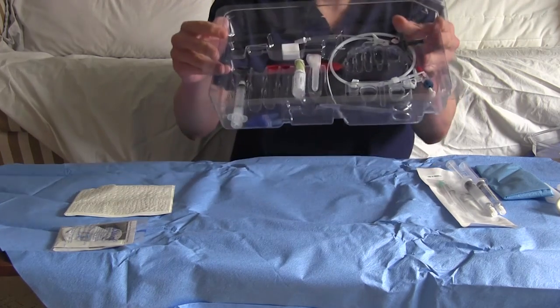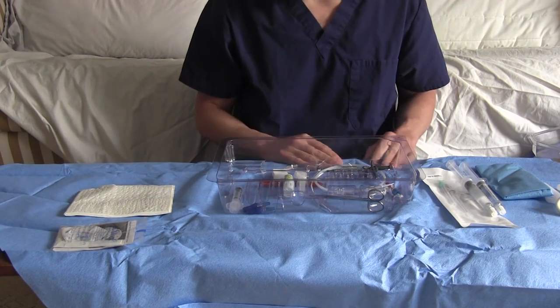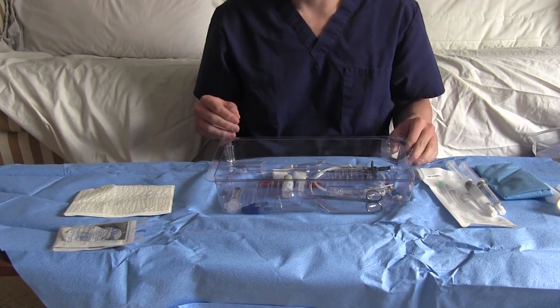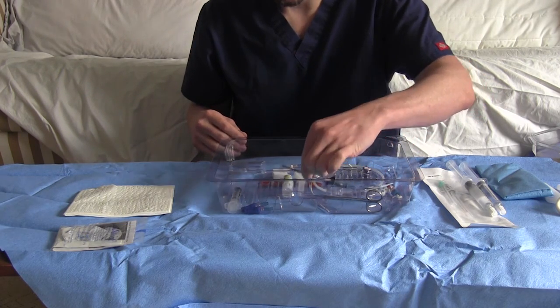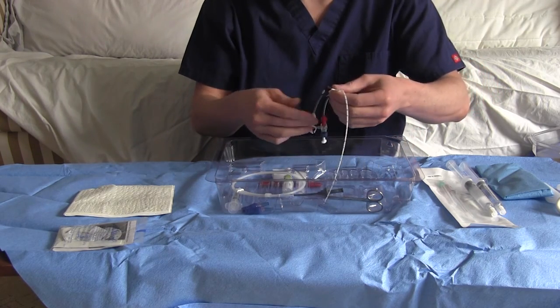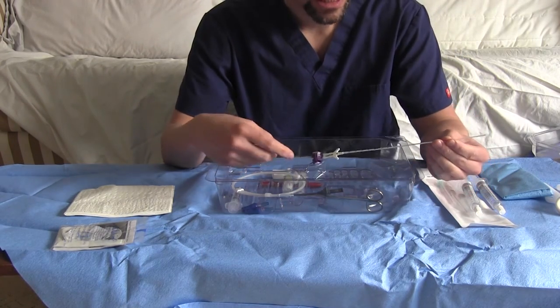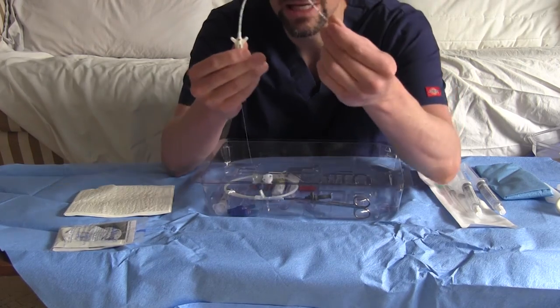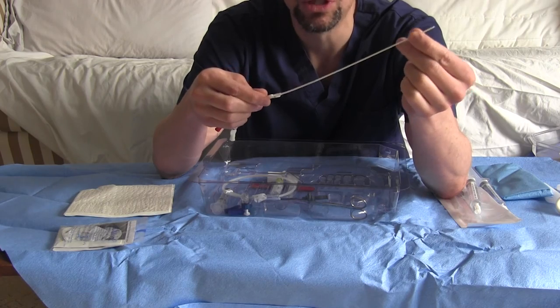And now this is the actual procedural portion of the set. And we're going to go through these one by one. So there's a lot of prep work that goes into this kit. What you want to do first is prepare your catheter. And that's a little bit more complex than you may be used to dealing with regular central lines and such. So I'm going to take you through it step by step. This is a 20 centimeter midline, but that may be too long for some patients.